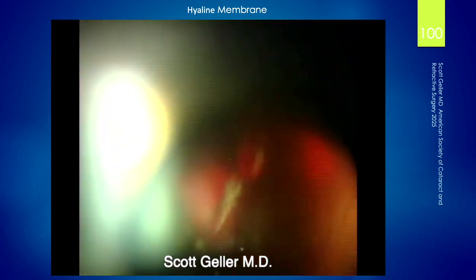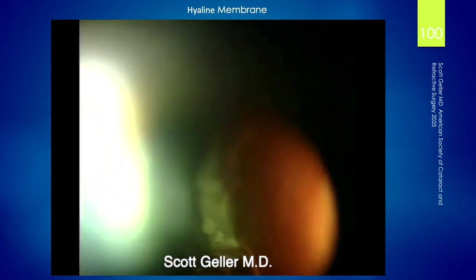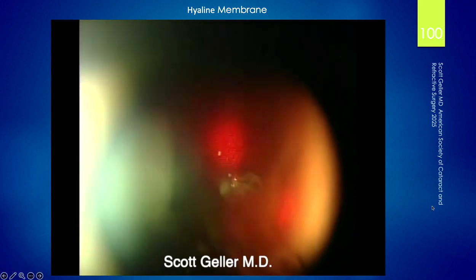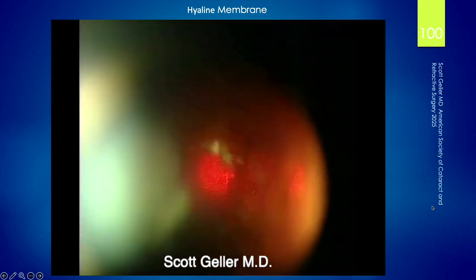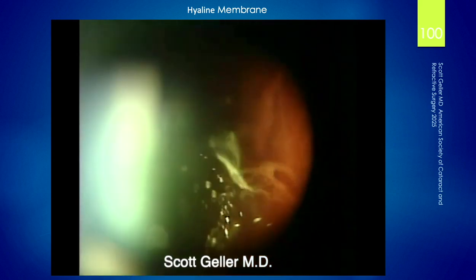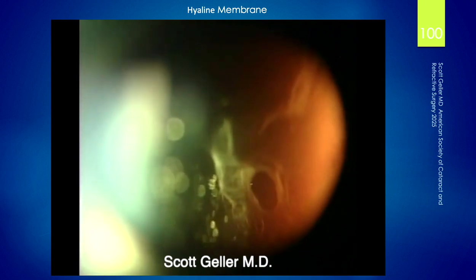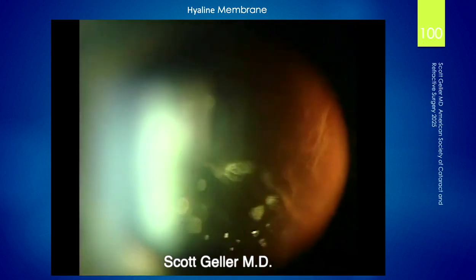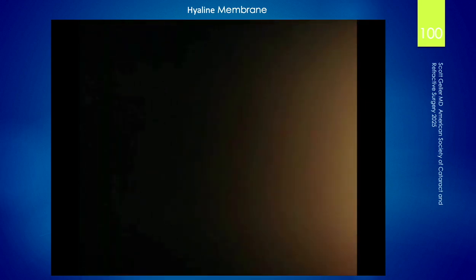So here we go. Got that guy. Look at that. Patient is better and happy. There it is. I might have done more laser, but for the sake of this presentation, I just keep it brief. But you can see there's a clear visual axis, or much clearer visual axis, I should say.